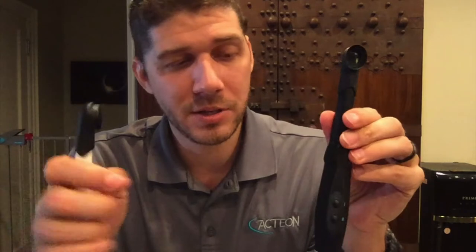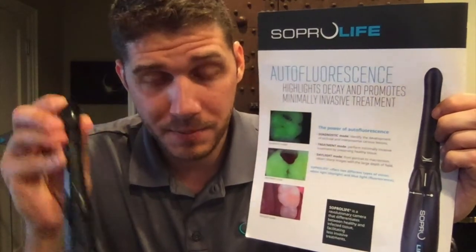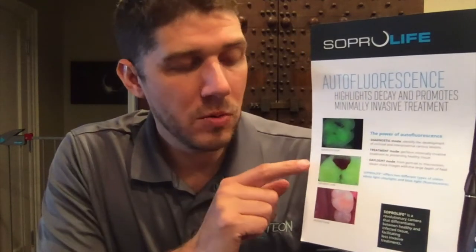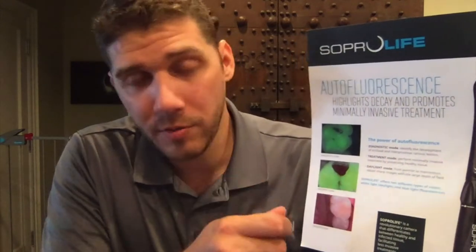The SOPRO Life camera features a diagnostic mode for caries as well as a treatment mode for caries. This camera is ideal in a doctor's hands — used to diagnose caries, and then once the patient has accepted treatment and you are removing the decay, it's used in treatment mode. The concept is that by utilizing the camera, rather than removing excess healthy tooth structure, you preserve the tooth and only remove the decay.